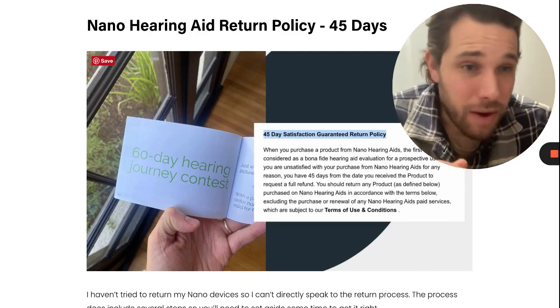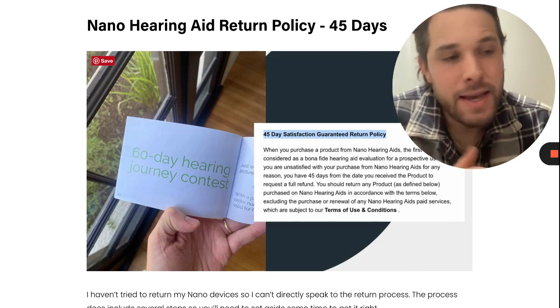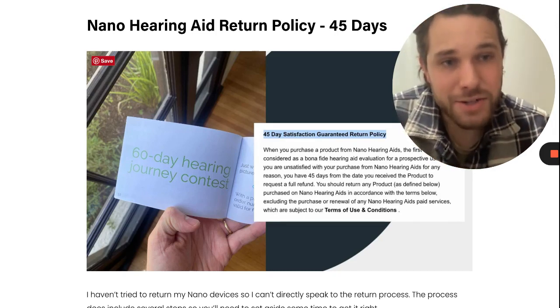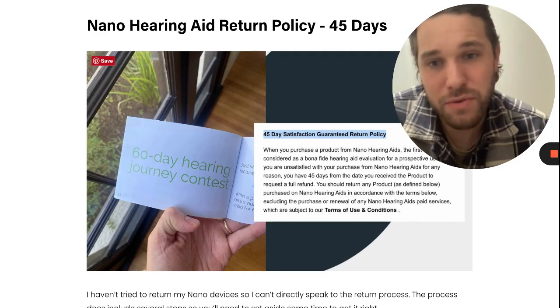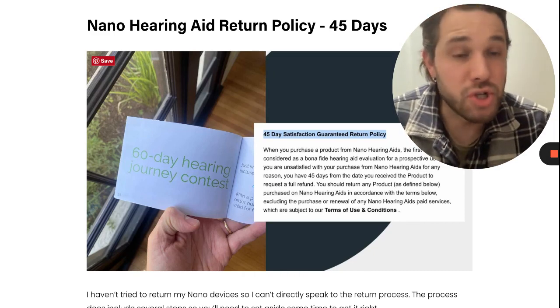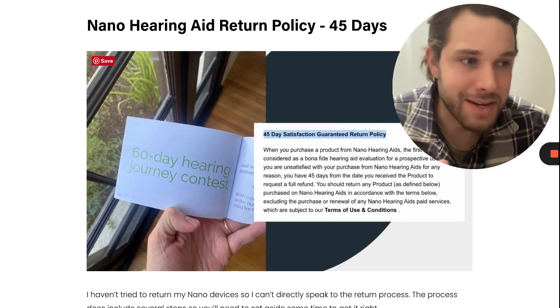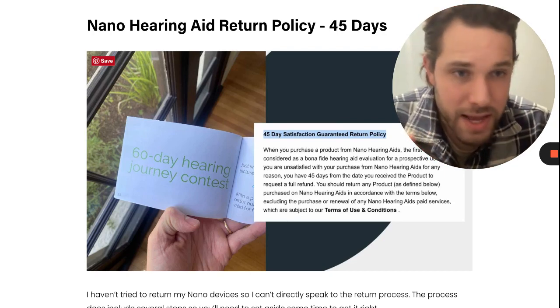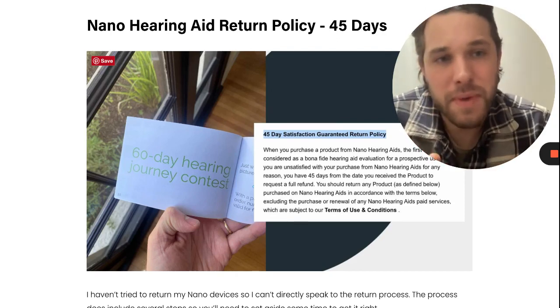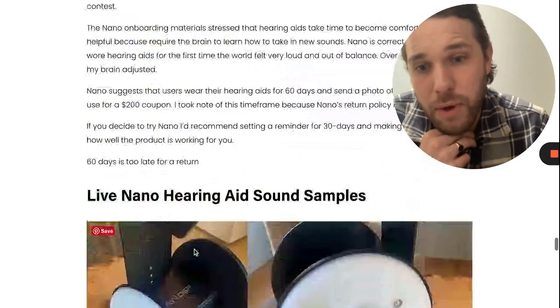There are a number of things you'll have to do in order to get a refund from the company. One thing I noticed is that throughout all the material, there's this promotion of a 60-day hearing journey contest. And I think it's just worth noting for anyone who's considering, 60 days is beyond the 45-day return window. So if you go through this 60-day hearing contest, which apparently gives you a coupon, you should just know that you're essentially forfeiting your ability to return if you decide to do so. So what I recommend is keep your hearing aids for 20, 30 days. And if you're finding some benefit, great. If you're not finding any benefit, just ship them back, get your money back, and maybe try something else. There are other quality products on the market.